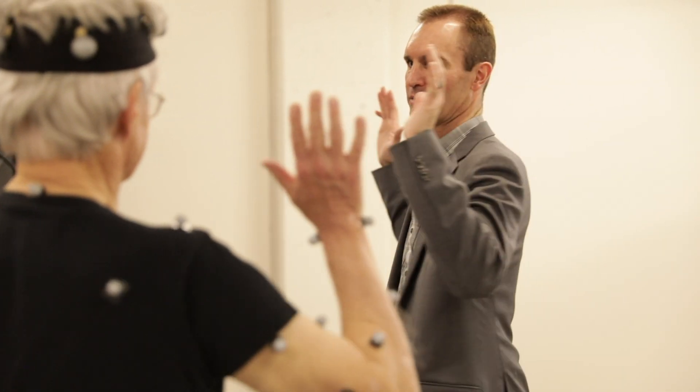Go ahead and do a little bit of a squat, and then back up, and put your arms up like this and rotate at the waist.